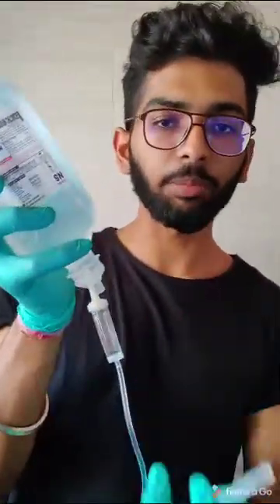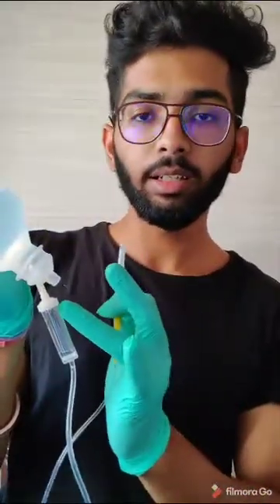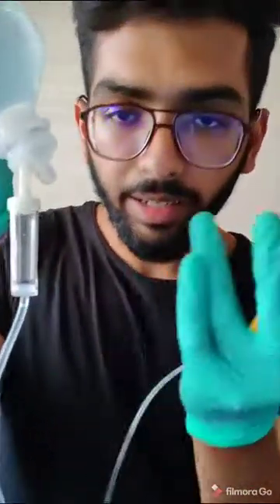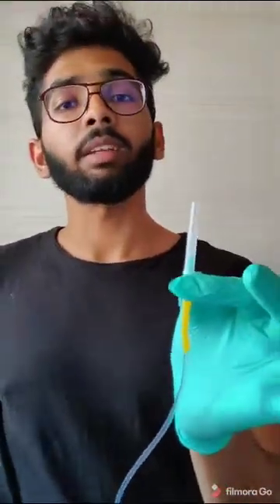Then next, what we need to make sure is that the IV set that I have already set up with the spike inside the NS solution, and as you can see, there is a little bit of the drug inside the chamber of the IV set. There we have the needle. Right now we do not have the use of the needle, as I have already set up the scalp vein set on the skin. We will remove the needle.